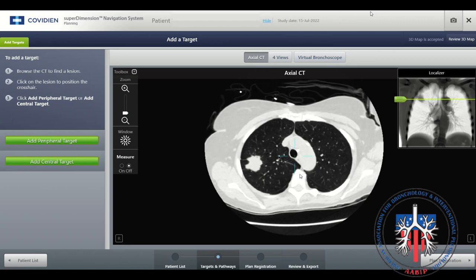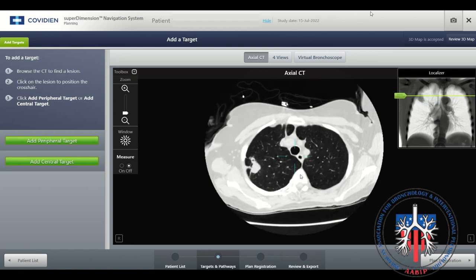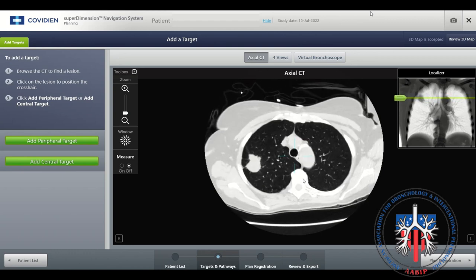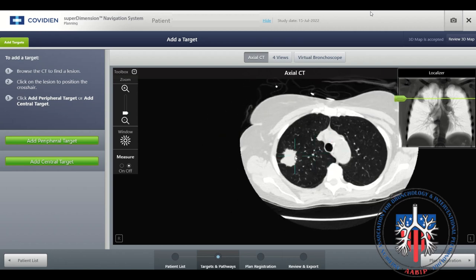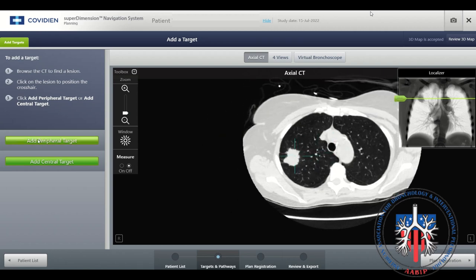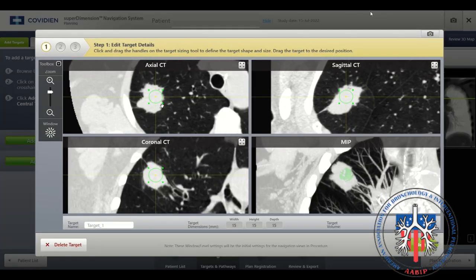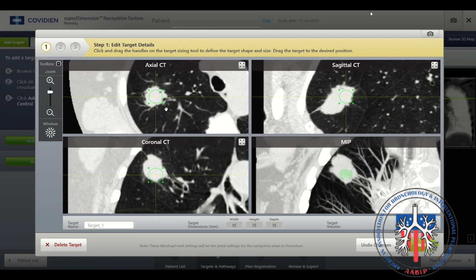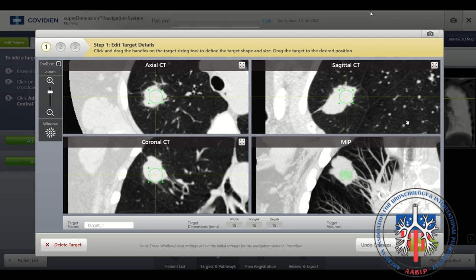The target nodule will now be marked. Scroll through the images until the nodule comes into view. Select the nodule and place the crosshairs on the nodule. Then select Add Peripheral Target. Now refine the target location. You can change the name of your target if needed, delete the target and start over, undo changes, or accept the target location.